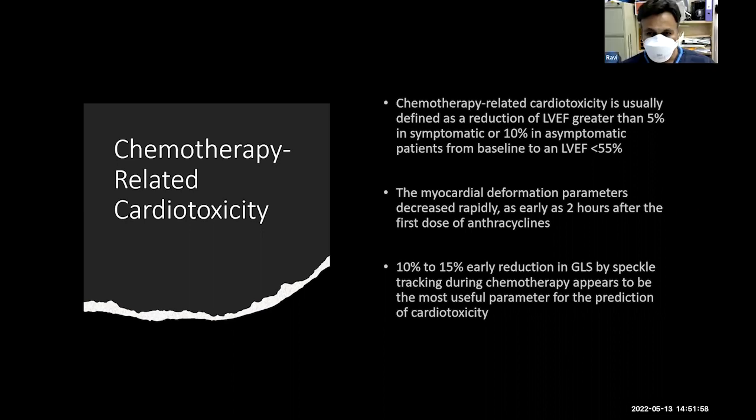Yes, Ravi. Does it show anything about diastolic dysfunction? Yeah, Sam, you can probably allude to that. I guess there's a pretty big paper from a lady called Gloria Landsberg in the critically ill looking into this. The short answer is yes, they can use what's known as strain rate, and you look at the E wave of that. I don't know if you've shown the graph. I haven't gone through the graph.